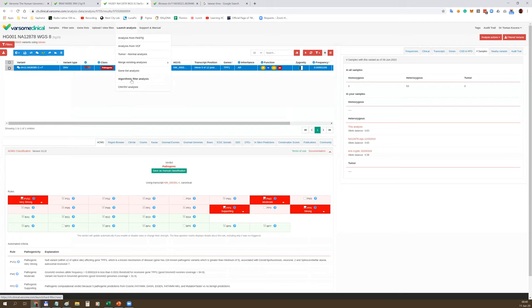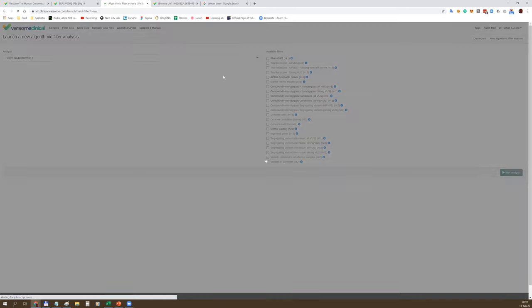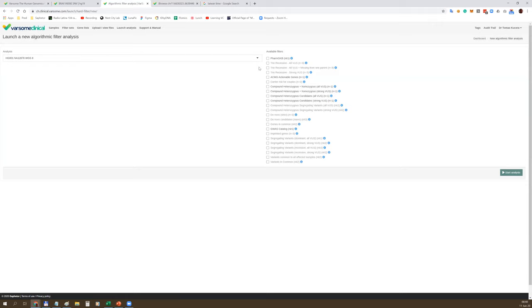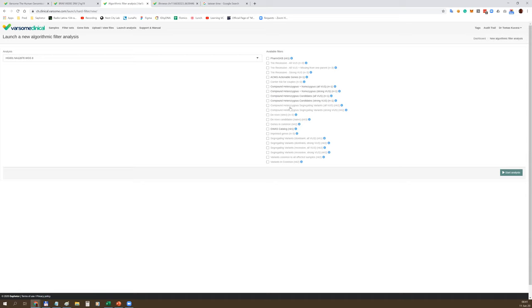You can always deactivate certain filters or bring them up again. You can also modify the whole filter set. For example, you can add an additional filter based on PP5 criteria with strong evidence. Now we have three filters and we are left with only one variant in the variant table. The results update dynamically, which is why we call these filters dynamic filters. That's not all - VarSome Clinical comes with another type of filters called algorithmic filters.